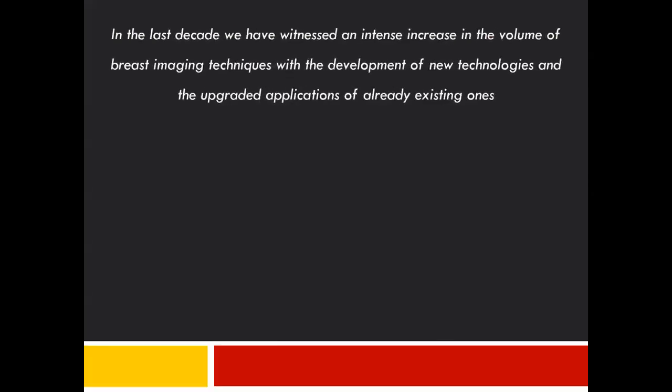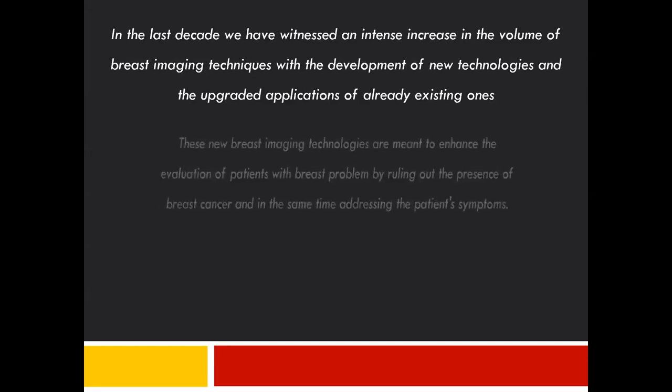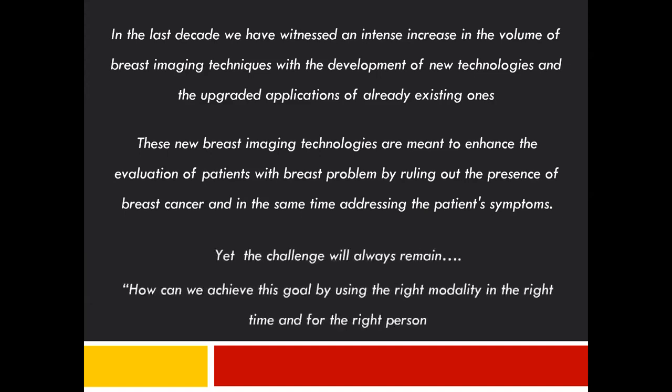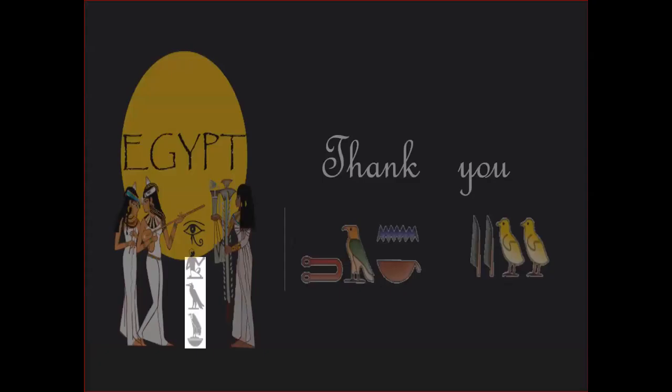And to end my lecture, definitely in the last decade, we have witnessed an intense increase in the volume of breast imaging techniques with the development of new technologies and the upgraded application of already existing ones. These new breast imaging technologies are meant to enhance the evaluation of patients with breast problems by ruling out the presence of breast cancer and at the same time addressing the patient's symptoms. Yet the challenge will always remain: how can we achieve this goal by using the right modality at the right time and for the right person?